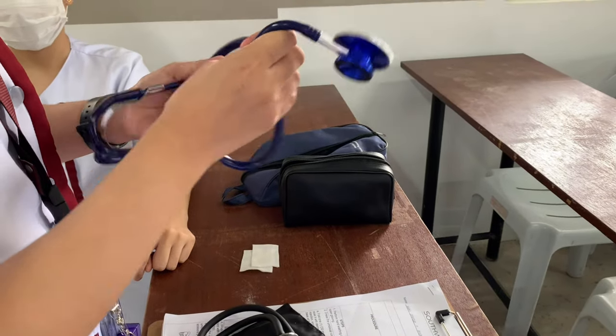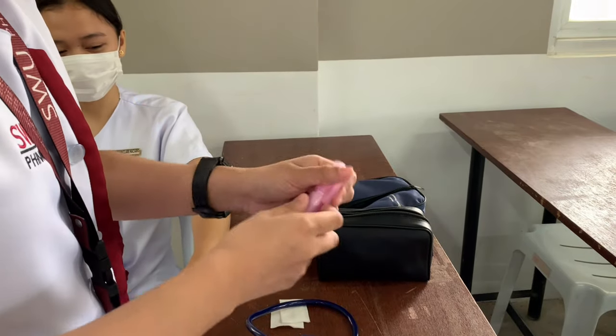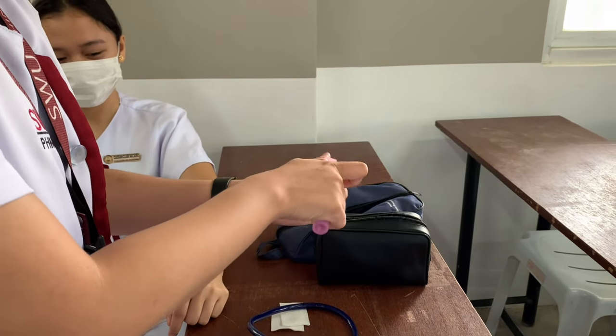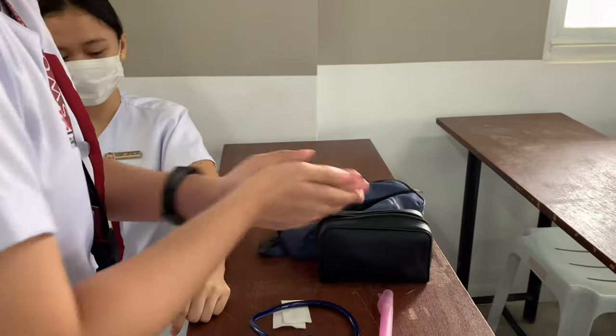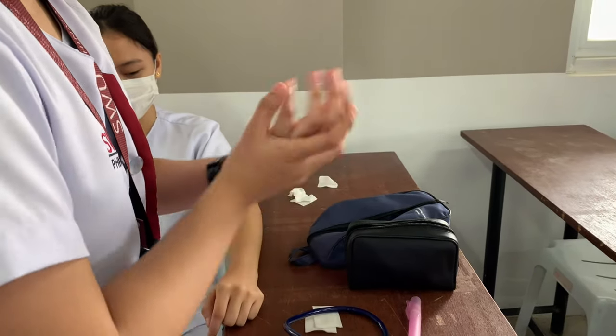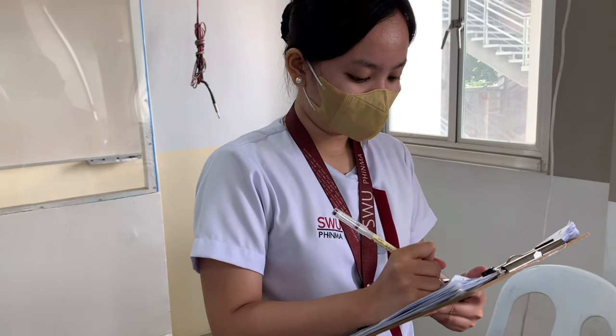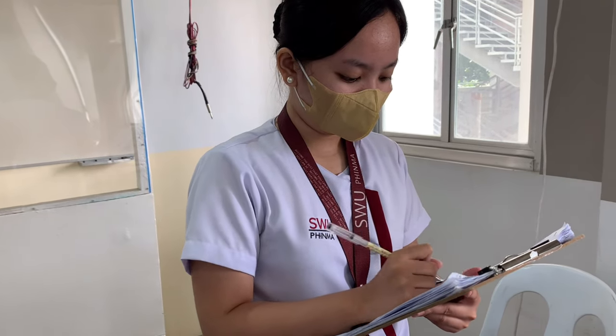Lastly, record the temperature, respiratory rate, pulse rate, and blood pressure reading on a flow sheet and indicate the time. Report any abnormal findings to the appropriate person. This documents the completion of the procedure and assessment findings of the patient, and it helps to determine the need for follow-up care.